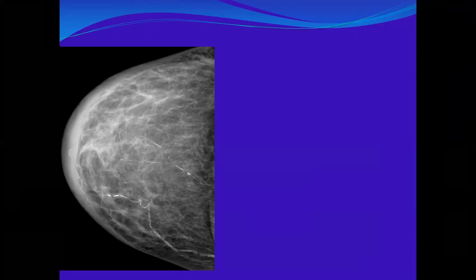Any history of renal problem, cardiac problem? Excellent, well done. Why did you ask about this? Because 3 months is a long time to be non-progressive. But find the clue in the sentence I told you: calcification is not common at this age.